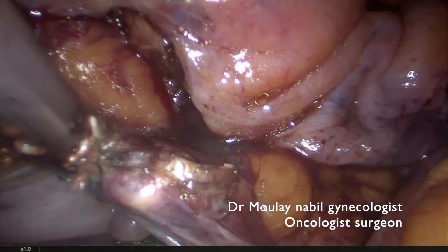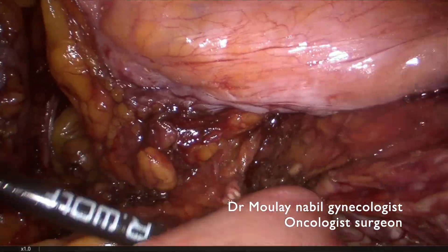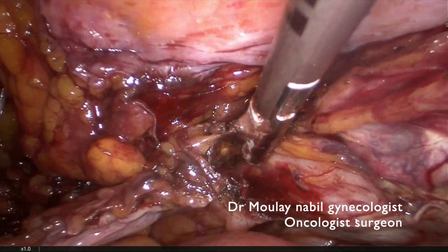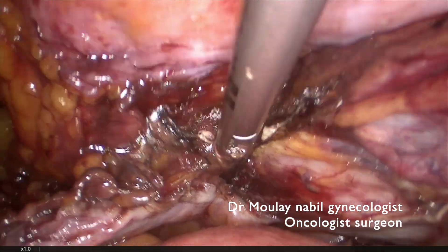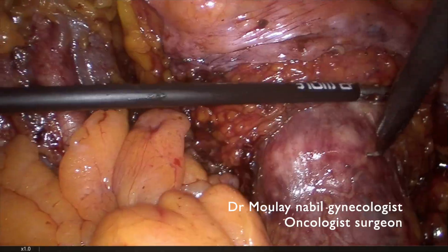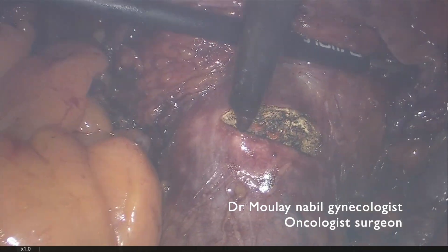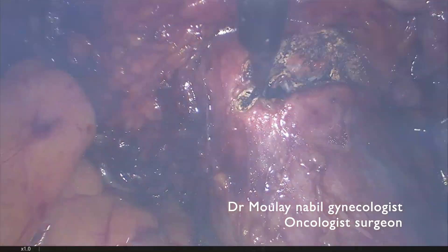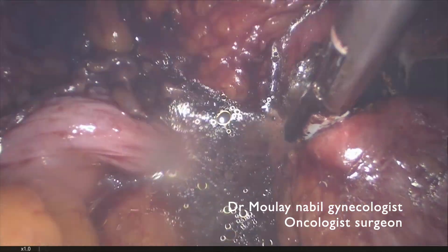You can see that if you follow these simple rules, the procedure, even in a very fatty patient, is quite bloodless. We can now cut the left uterine vessels, and the uterus should be well devascularized so we can do it safely. Now we use a monopolar needle and cut the anterior aspect of the vagina. In the fatty patient, we prefer to do it with the ligational sealing device, particularly on the lateral aspect of the vagina, which is sometimes very vascular.